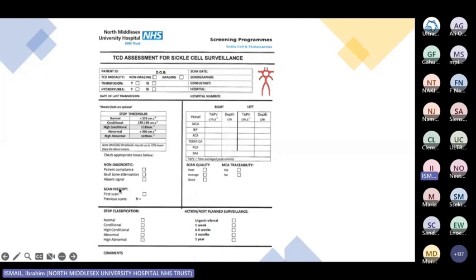But in the example that I said before, I would do an examination within 6 to 8 weeks, but I'll be wary. Sometimes I might even make it a little bit less, more towards 4 to 6 weeks at that point, considering it's just below 200.